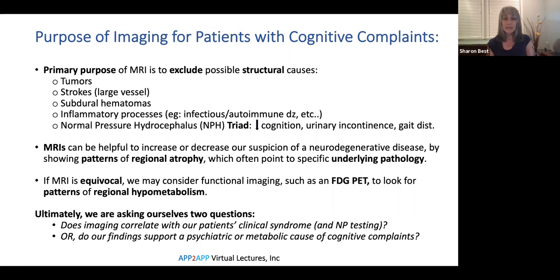For Alzheimer's disease, we generally have a medial temporal lobe and posterior parietal cortical atrophy in greater proportion to the rest of the cortex, and the underlying pathology that points to is amyloid plaques and tau tangles. In contrast, for semantic variant PPA, we have a classic MRI finding of anterior temporal polar atrophy with left greater than right, and that typically points to an underlying pathology of TDP-43, a whole other type of protein.